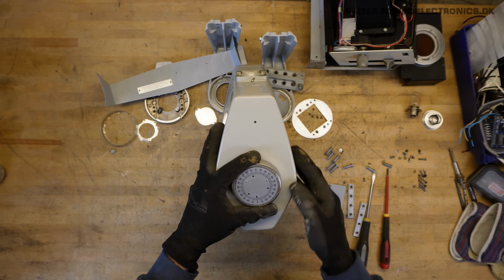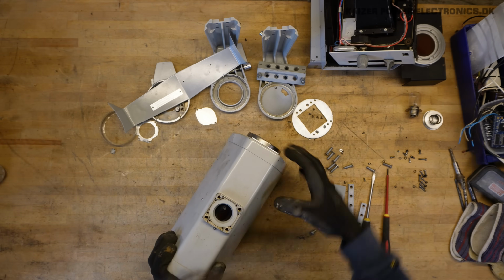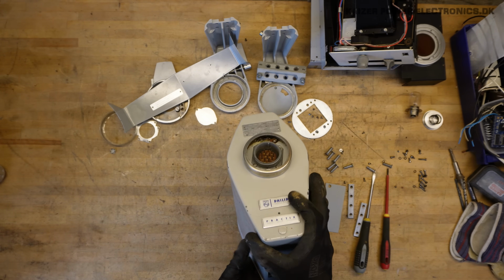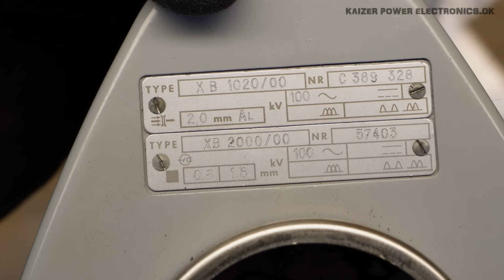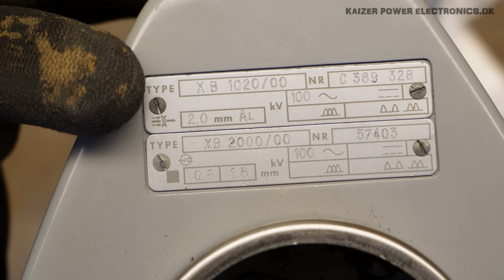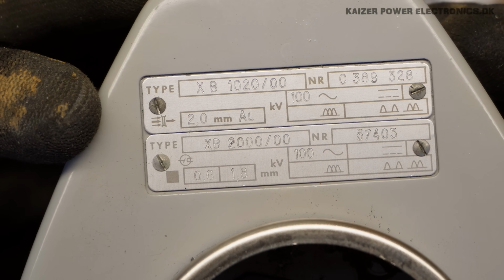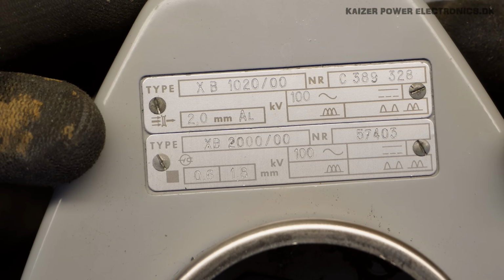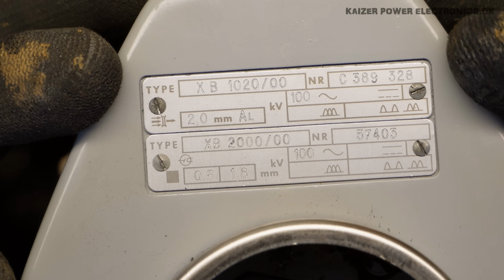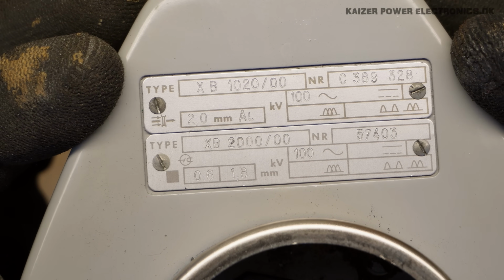Okay, we have some kind of degree wheel here on the side. I think it was here. Yeah, the marking plate. Here we have it: the type XB 1020, 100 kilovolt. It has built-in 2 millimeters of aluminum filtering, and that's about that. I'm quite unsure why there are actually two marking plates here, if that has to do with the small and large focal point.